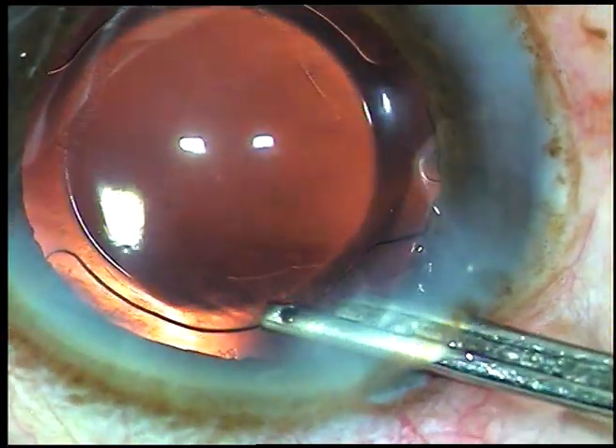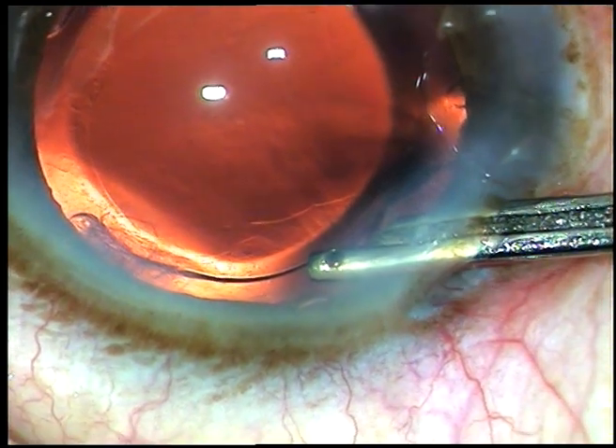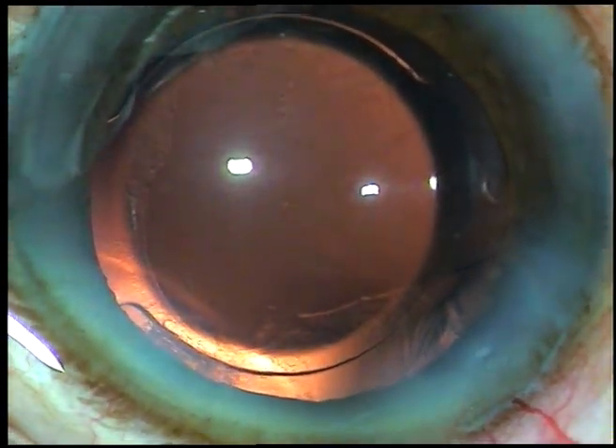This is the final lavage of the anterior chamber after hydration of the side ports. And here I conclude the case. Thank you very much for watching. I hope this video will help you in developing your surgical skills.